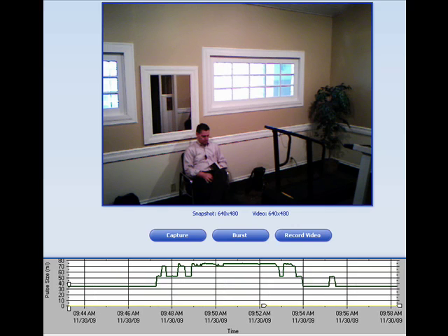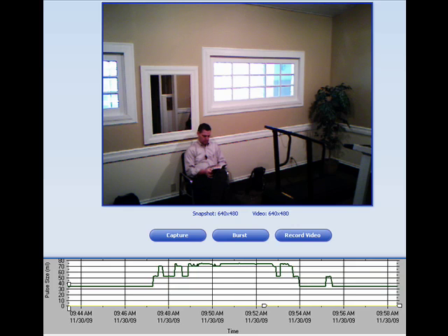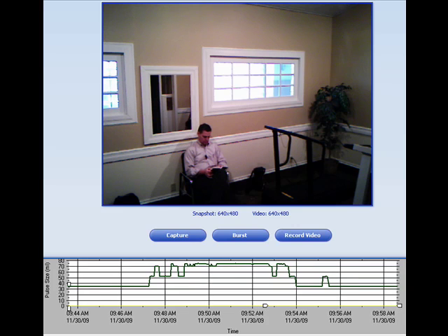And there we have it. That's the quick demonstration of how SmartDose auto-adjusts to match the oxygen dose with the exertion level of the patient. If you're wondering just how it works, it monitors breathing patterns, establishes a patient's restful pattern, and recognizes the difference as patients move from rest to exercise and back again.